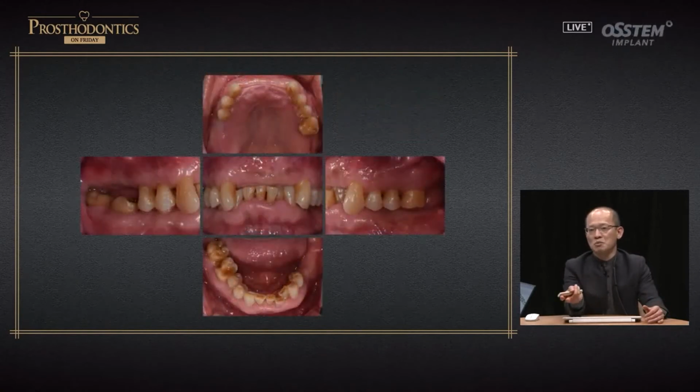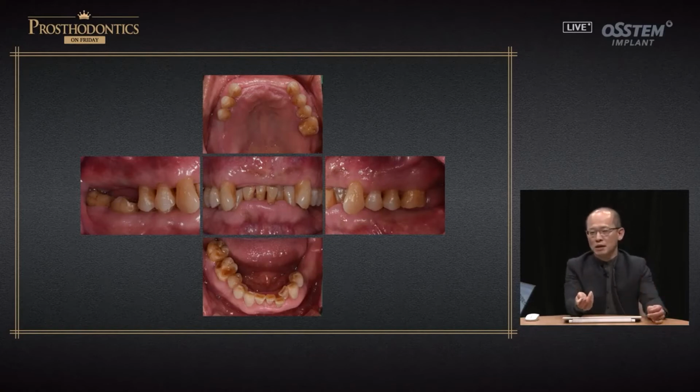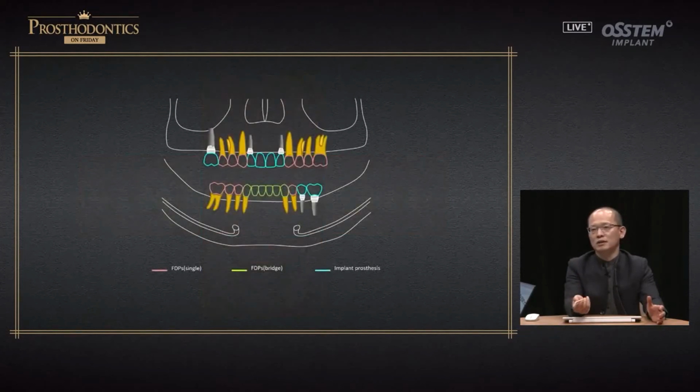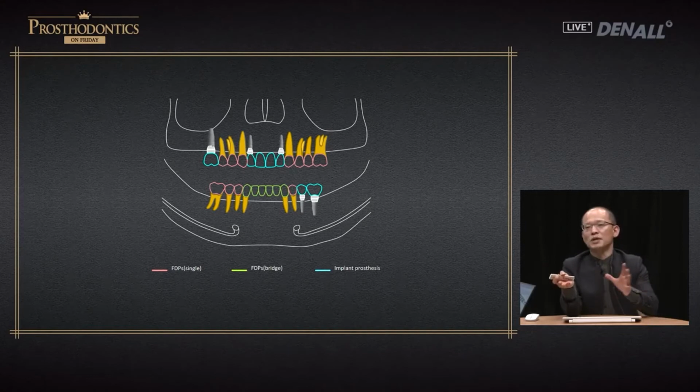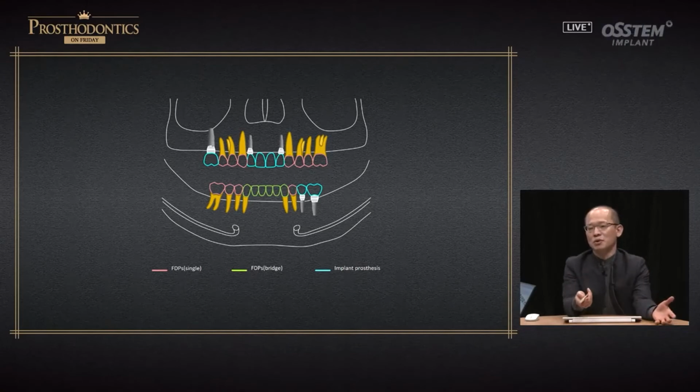So this is after everything has been aligned, and on the anterior mandibular side, you see there is not much support on the posterior side, and after extraction there's a lot of collapse. So with the implant, this becomes a very simple treatment plan, and there's a sectional bridge, and you can have a full mouth maintenance. So that is the strength of using implants. So that would be the first treatment option.